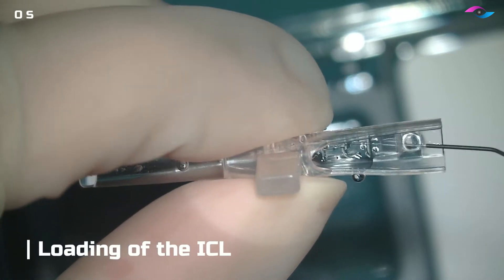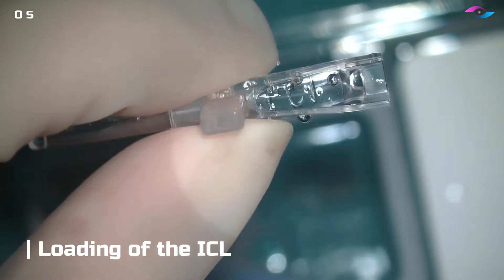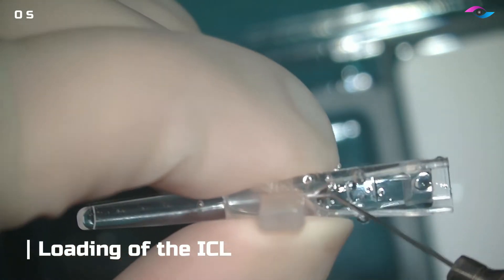Hello everybody, this is Dr. Ikeda and today I'll be sharing with you the technique of a toric ICL — how to load this lens and how to implant it inside the eye.